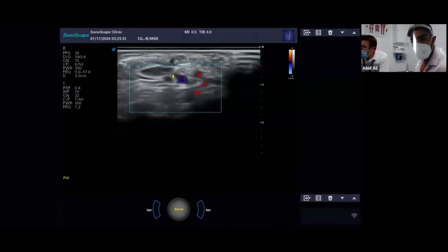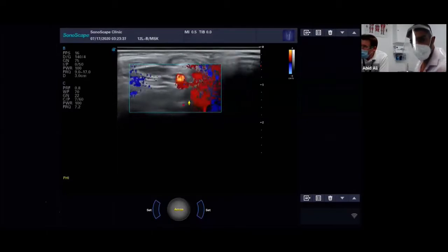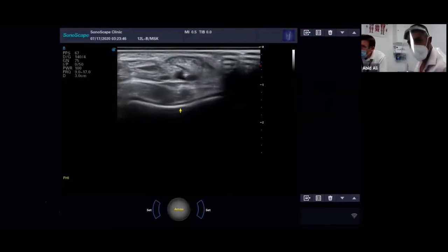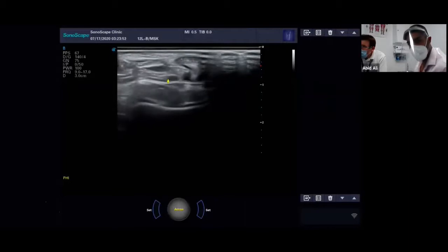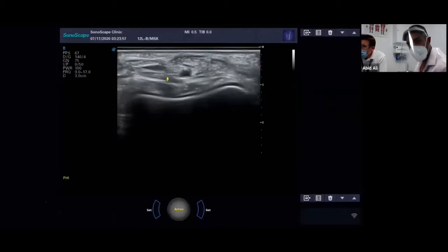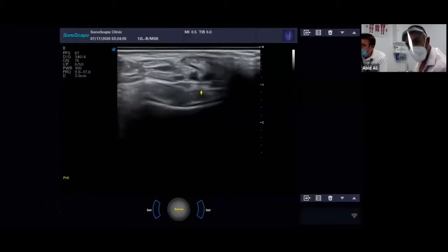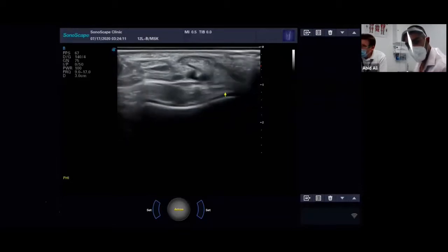The point here is, especially when you're a beginner, you want to put a lot of pressure on the probe, and we're all maybe a little heavy-handed to start with. But hold it the same as a pencil, because if I show you what happens when I put a little bit too much pressure on it, can you see those three little round shapes, that neurovascular bundle? I'm compressing it. You can see the artery pulsing away, but I've compressed the artery and the vein. So you can end up mimicking pathology or not seeing things if you compress too much. You can see we're even compressing the tendons there.